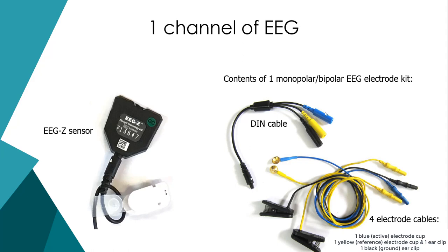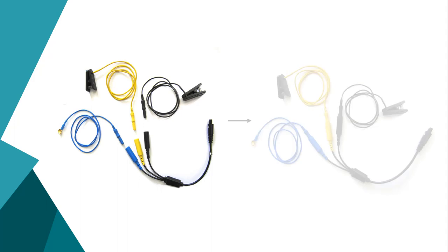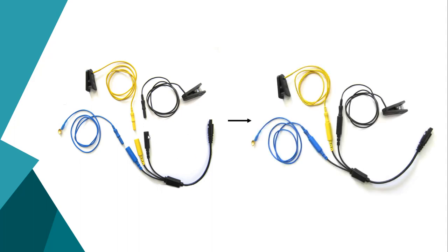In the equipment you receive — what we call a monopolar bipolar electrode kit — you'll have four different electrode cables: one blue cup for the active electrode, a yellow cup reference, a yellow ear clip reference, and a single black ear clip ground. For this monopolar referential montage today, we're going to be using the blue cup, the yellow earlobe clip, and the black earlobe clip. You insert the electrodes into the little DIN cable plugs, push all the way in — it's very snug — and you'll hear a click when it's done going in as deep as it can.